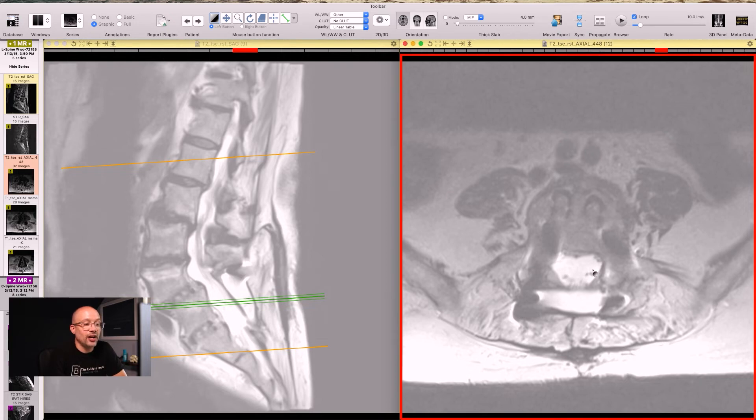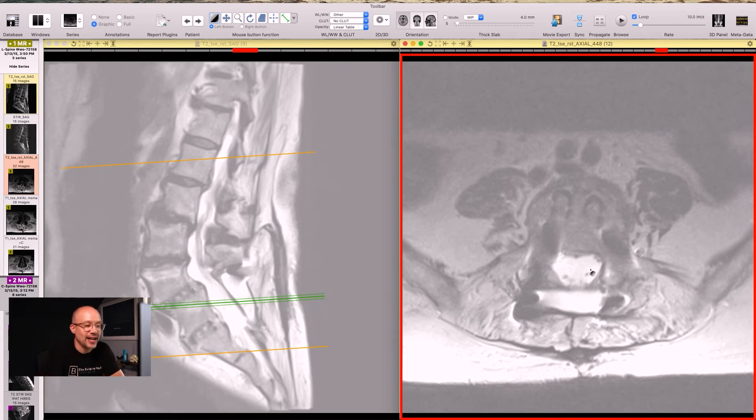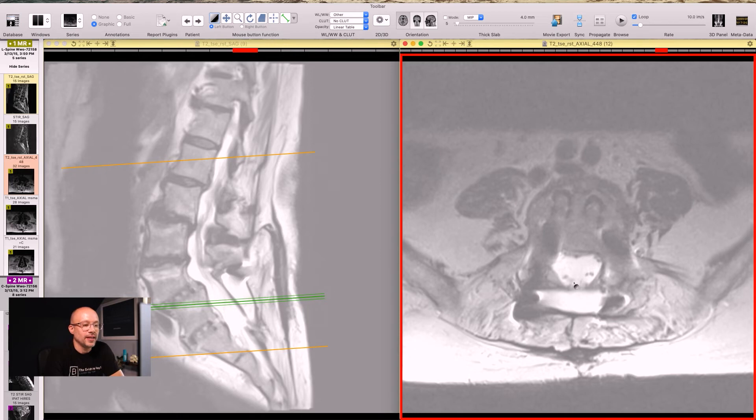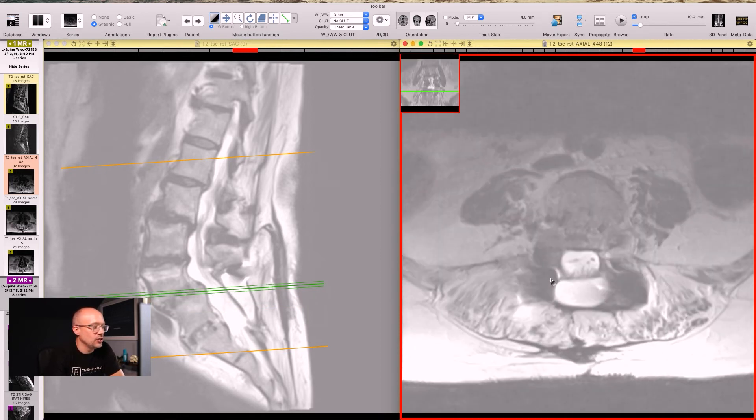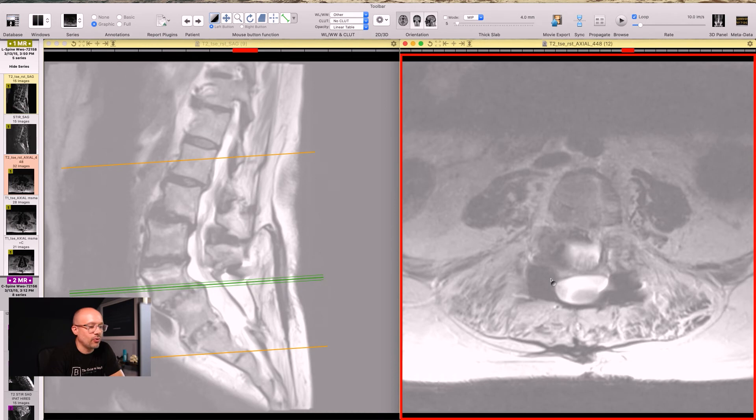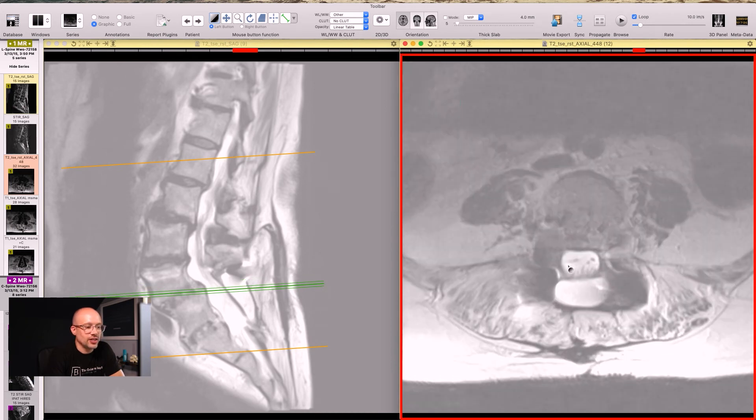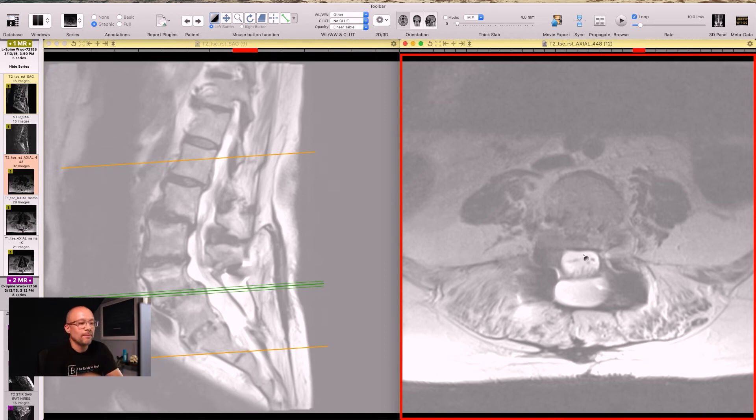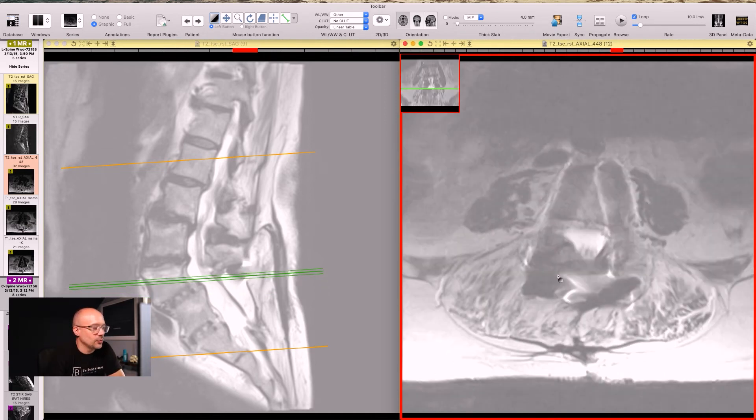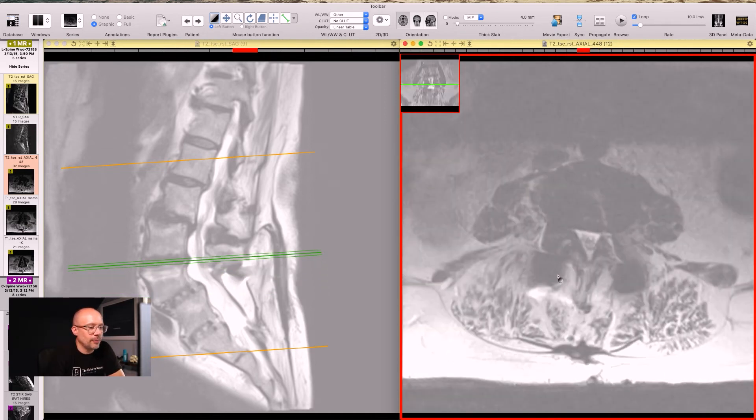Now the spinal canal looks wide open and that's fantastic. You can see how tall it is here and how wide it is across. It looks fantastic to continue up to L4, L5. You can see that again, fluid collection sitting right behind, right next to that spinal canal, but it looks great overall as we continue to go up.